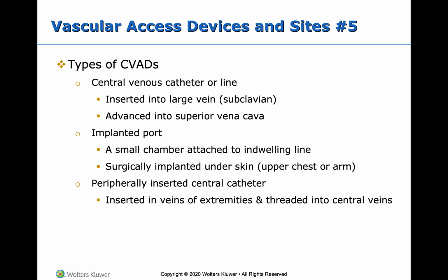So if you need a 5 milliliter lavender tube and a 5 milliliter coag tube, how many cc's do you need? 10 cc's, okay? So that's how you're going to figure out how much blood you need the nurse to draw, by looking on your tubes and doing some simple addition.